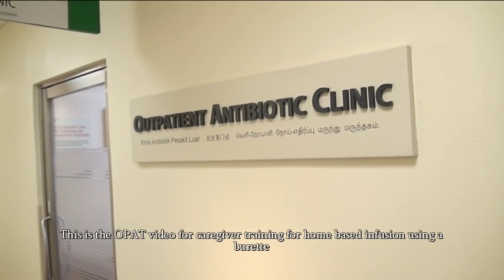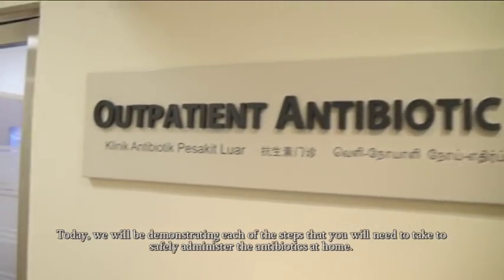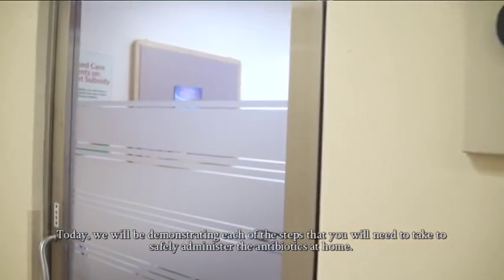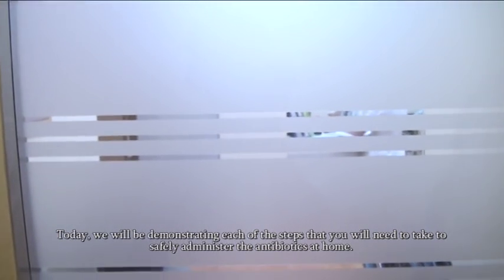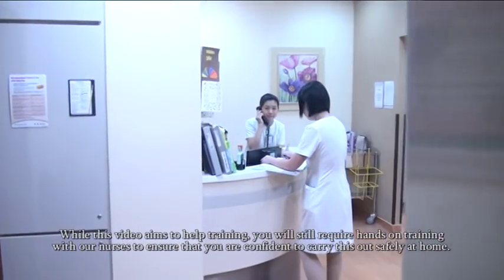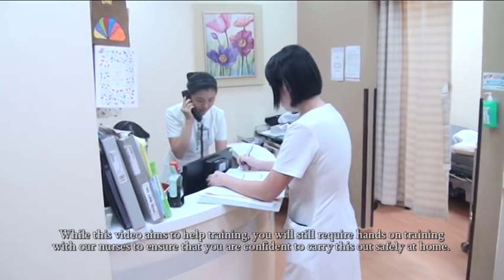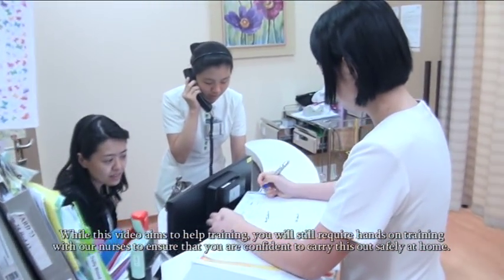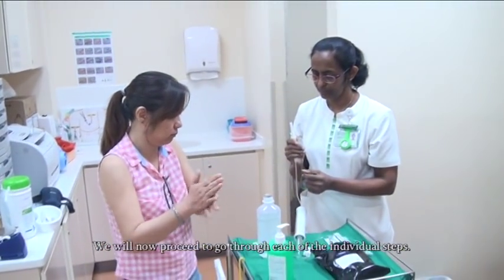This is the OPAT video for caregiver training for home-based infusion using a burette. Today we will be demonstrating each of the steps that you will need to take to safely administer the antibiotic at home. While this video aims to help training, you will still require hands-on sessions with our nurses to ensure that you are confident to carry this out safely at home. We will now proceed to go through each of the individual steps.